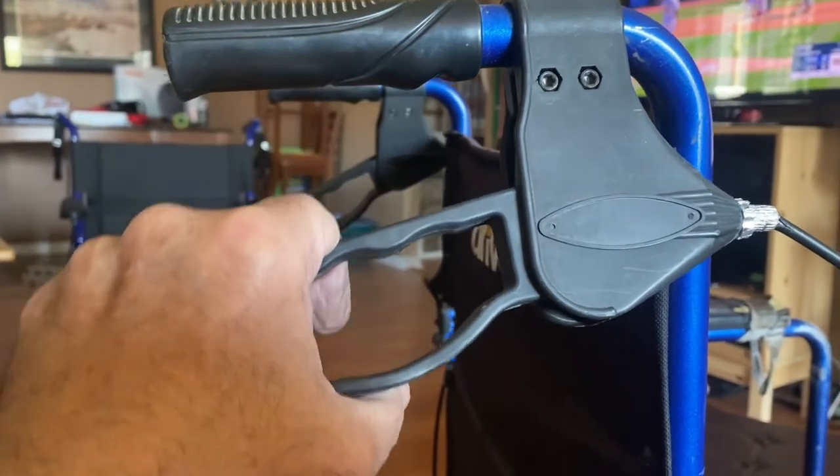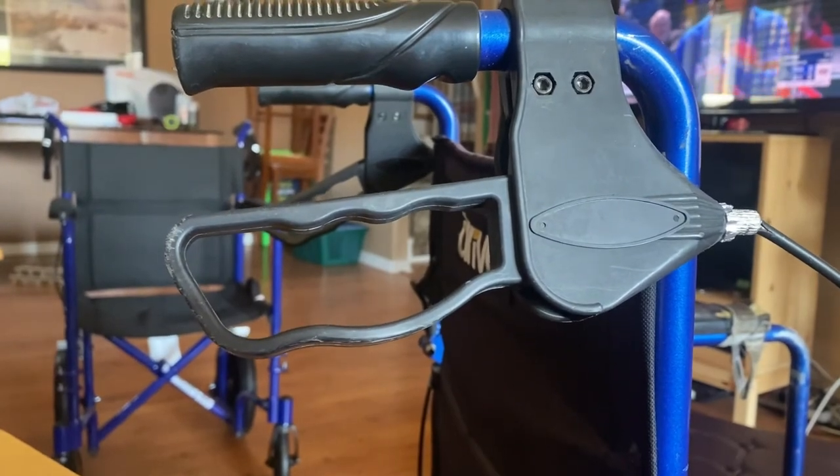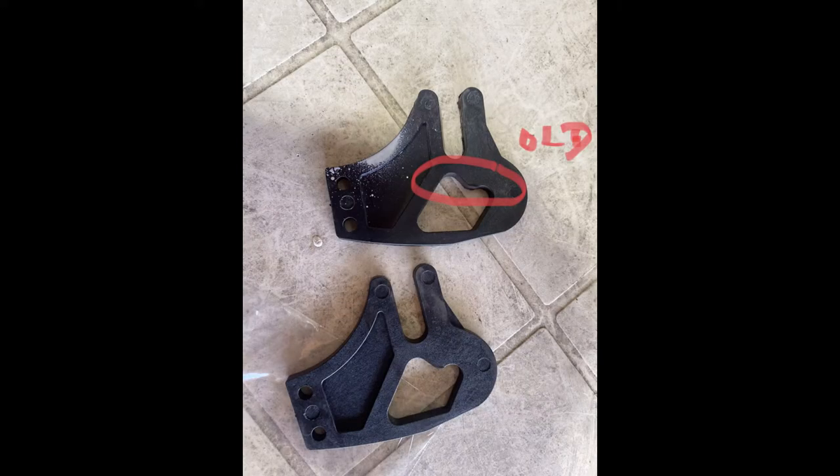When I try to lock the brake it keeps coming back. When I took apart the handbrake, these are the pieces involved. We're seeing in the circle that portion of the unit was worn down to the point where it would slip.